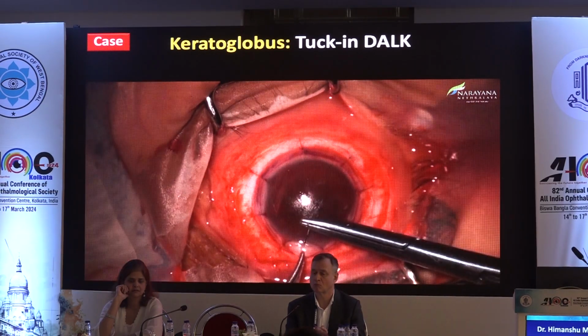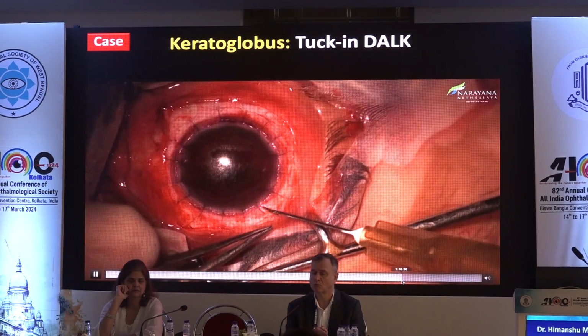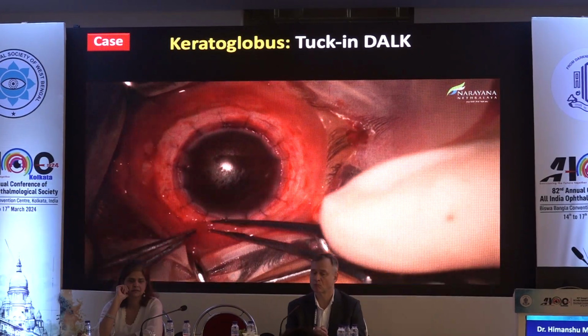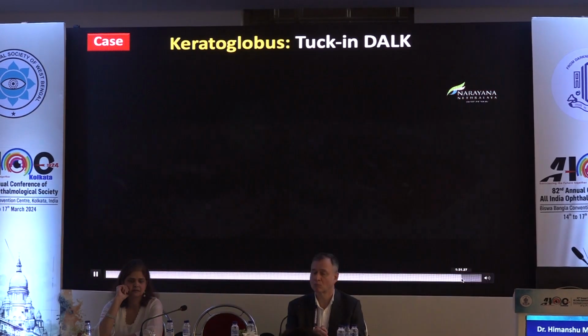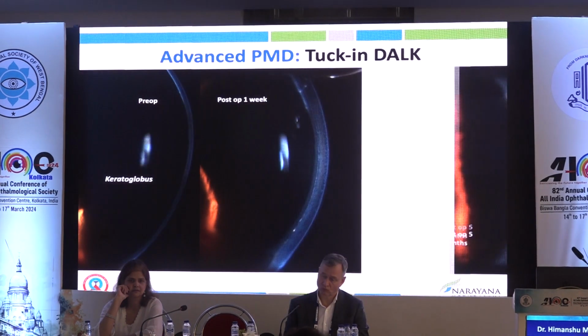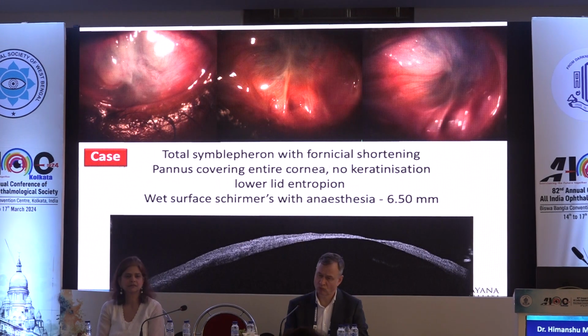Once you tuck in all the cornea and put all the sutures in place, then it's the time to replace your limbal palisade which you had displaced earlier. What it does is it prevents any chances of epithelial healing related issues, and ultimately you end up having a significantly decent outcome. Thankfully, post-op the patient had an excellent visual as well as optical outcome.